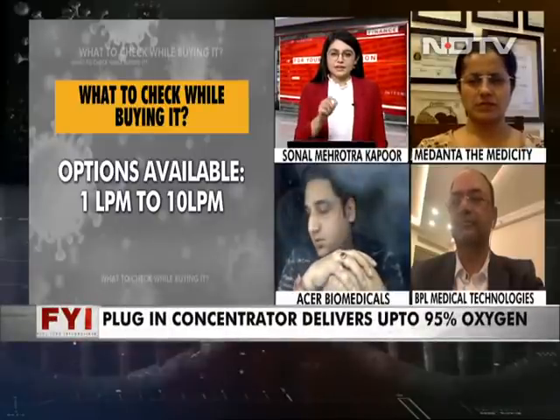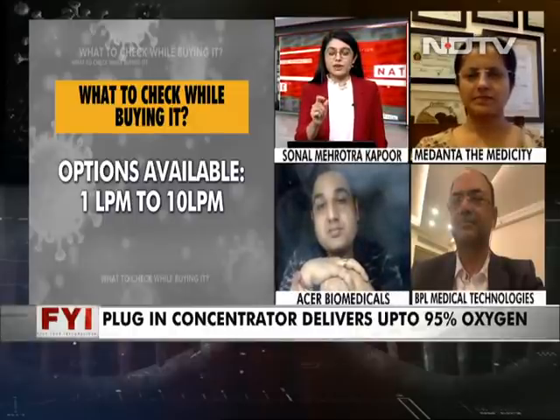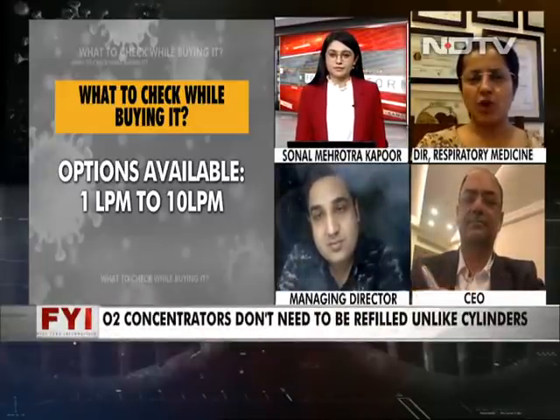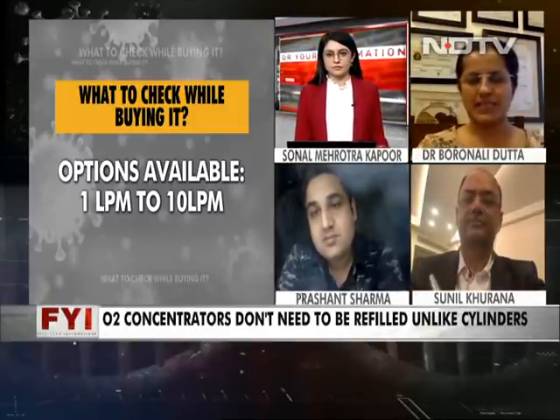Right. But let me get a medical perspective on this. Dr. Datta, if you want to come in on that one. How many liters is actually useful and for whom? Yeah, I think Prashant is right that if we are talking about the home setting, we are looking at low flow oxygen. We are looking at moderate disease. And as we said, bridging the gap for a severe patient to reach hospital. So 5 liters for the majority will be perfectly okay. And this time, because of the shortage of beds, the cohort of patients that we would have admitted last time, we're actually treating at home with oxygen and high-dose steroids and other things in the home setting. But again, yes, if your oxygen requirement is going up steadily, then home is not the best place.